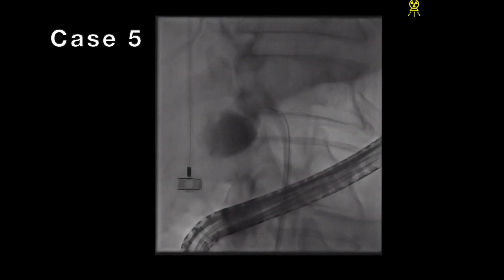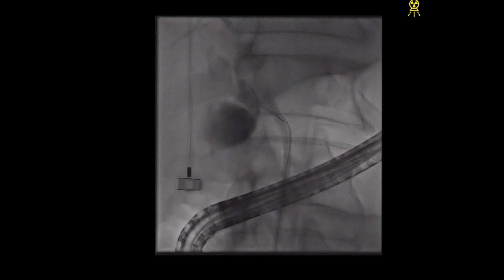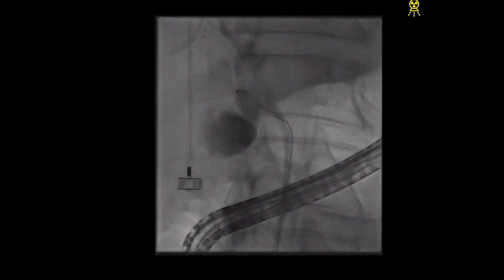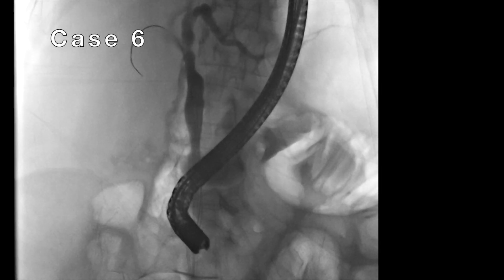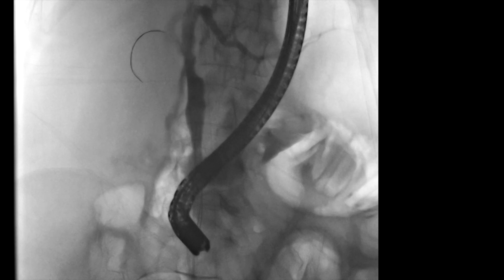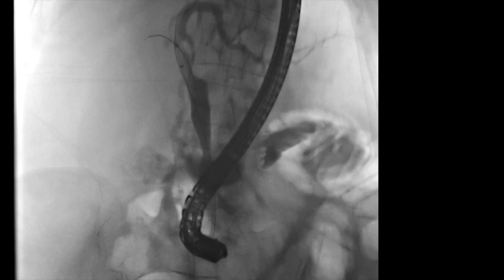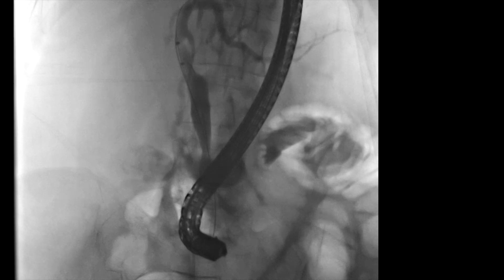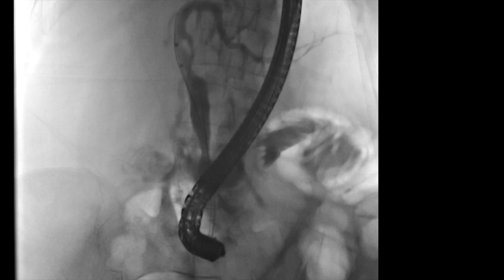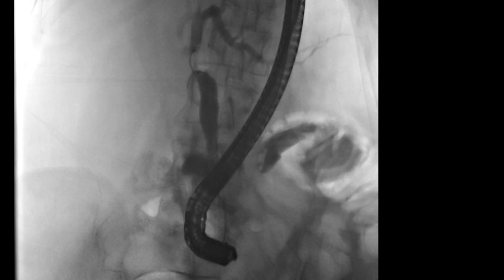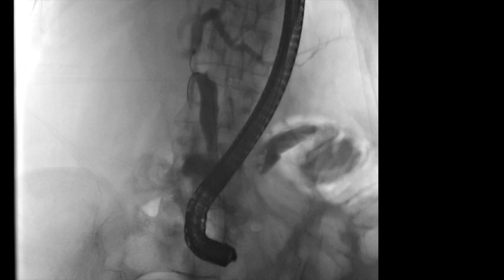Other equipment considerations include use of a rotatable catheter system with bowing capabilities, as well as using a balloon for anchoring and balloon occlusion of more proximal ducts to facilitate access to a duct of interest like the cystic duct. To utilize the balloon occlusion technique, deep access is obtained to the most easily accessible duct. A second wire is then passed alongside and the catheter advanced. The balloon on the catheter is then inflated to occlude the common hepatic duct, followed by withdrawal of the first wire. On advancement of the wire, the inflated balloon helps direct the wire into the cystic duct.